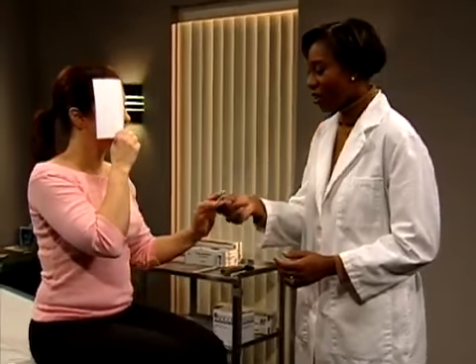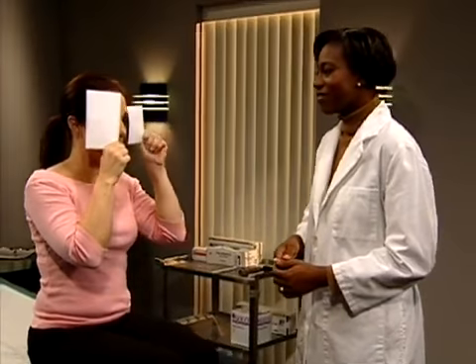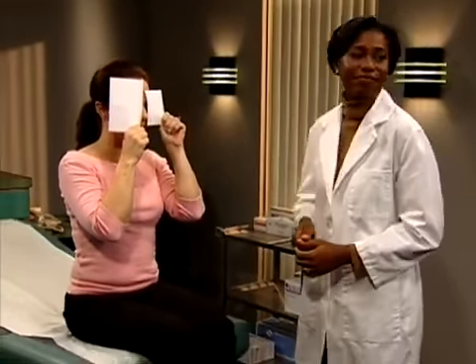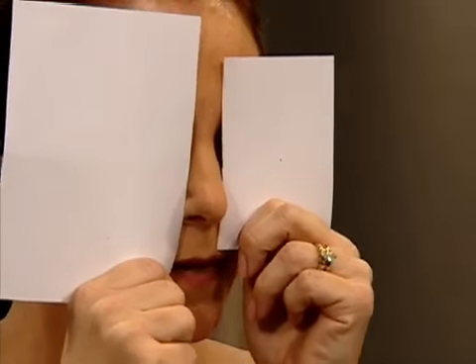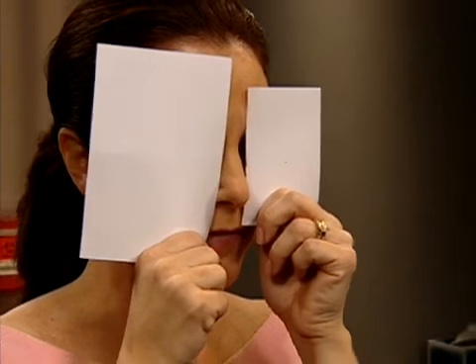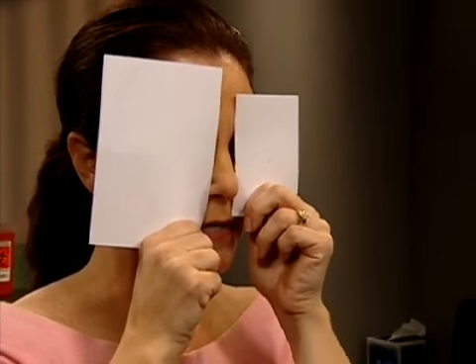Now cover your right eye with the card. If the patient's distance vision is less than 20/20, have her hold a card with a small pinhole over the uncovered eye and read the chart again. Your left eye. If visual acuity was reduced by a refractive error, this should improve acuity by at least one line. T-E-C.